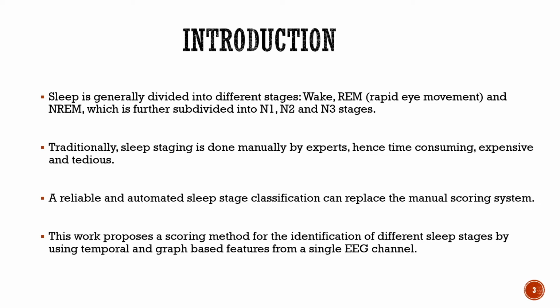Now traditionally the way sleep staging is done is by expert scoring, but it is very time consuming, expensive and a tedious job. Plus it involves a lot of subjectivity, so it suffers from this inter-rater variability. Hence there is a need of a reliable and automated sleep stage classification which can replace this manual scoring system and thereby reduce the burden of these experts.